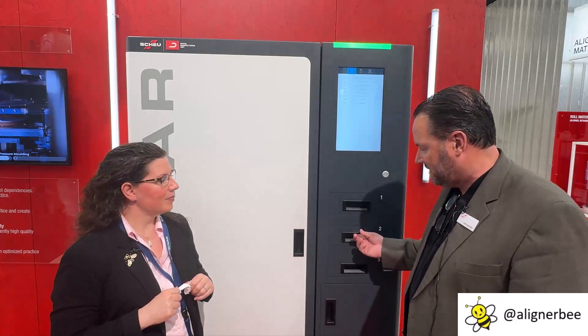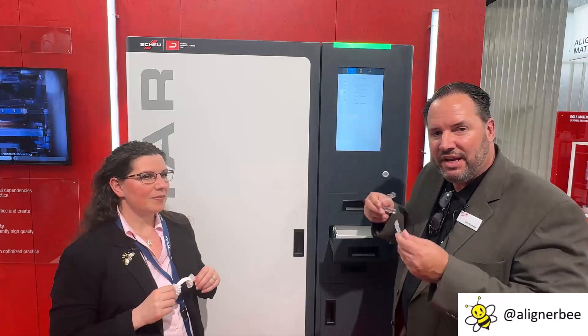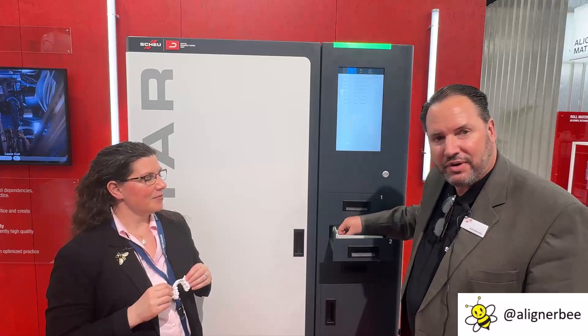How can I get going with that process from my intraoral scan, and how long will it take me to have their first set of aligners? That's a great question. So once we have the patient's scan, we can send it to the machine and within 30 minutes, we can have a couple of trays — one upper, one lower — to get that patient just familiar with the trays in their mouth to then proceed to full treatment by the orthodontist.